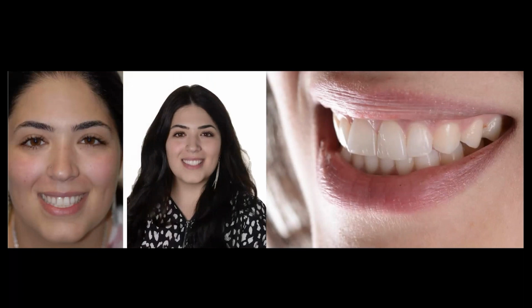I know I always say that I treat almost every case like it's a denture, meaning that I don't care if it's crown and bridge or it's going to be a denture or some part of an implant case. I'm always trying to look at the face, look at the angulation, and understand where the incisal edge belongs in that face. Also in the denture world, it becomes a little more complicated because sometimes we're dealing with more lip support. This happens in crown and bridge world too, especially in the implant world. We're not only looking at putting the incisal edge into the face in the right position, but also we need to support the lip and the architecture when there is bone loss and lack of support underneath it.